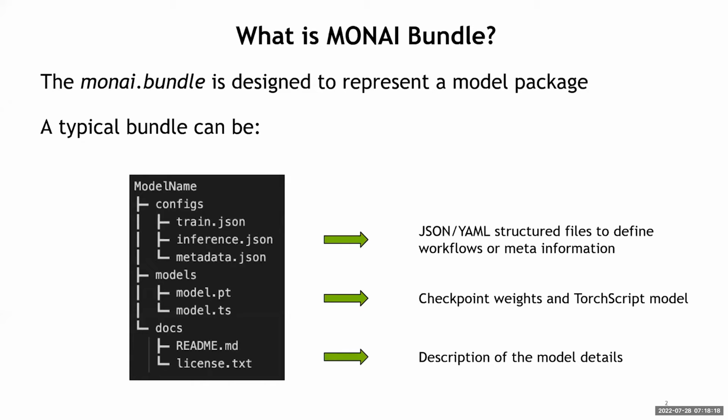The idea with the bundle is to include all that semantic information into one package that you can then distribute to other people, and they can read it as humans, just reading the JSON files, for example. And these are meant to be human legible. And so they can look at this and be able to figure out what the model is for, what it does, what its inputs, outputs are, and so on and so forth. And you can also include with this any other information you like. So authorship, copyright, or license, or source of the data, or plain language descriptions.